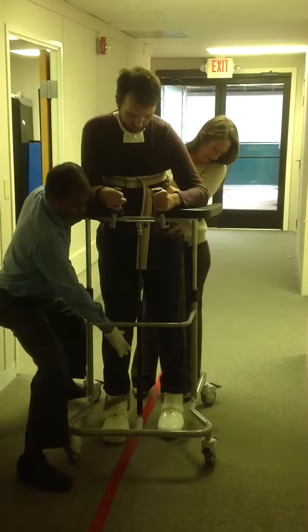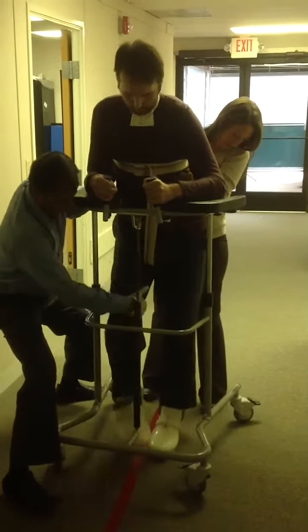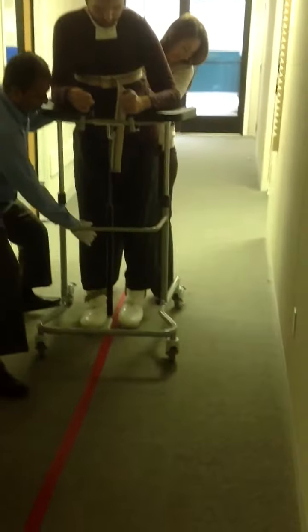Okay, adjust the walker now. It's a little bit closer. Step a little bit wide now.